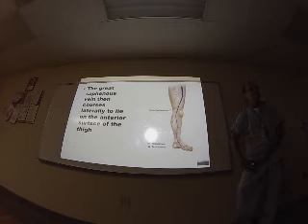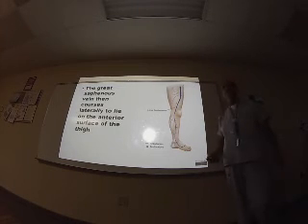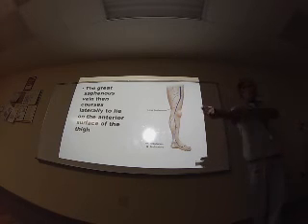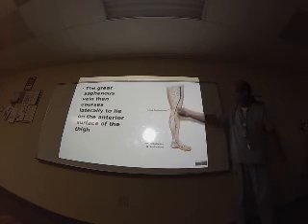You go very slowly, measure the vein, and with a marker, you mark the vein, so the doctor can open, close, and put the vein away. If you see people with a bypass, you can see the people have no saphena. In general, sometimes they use another one if this saphena is not good. If the vein is varicose, it's not good. It needs to be a vein in good condition. Great saphenous vein, or internal saphenous vein.